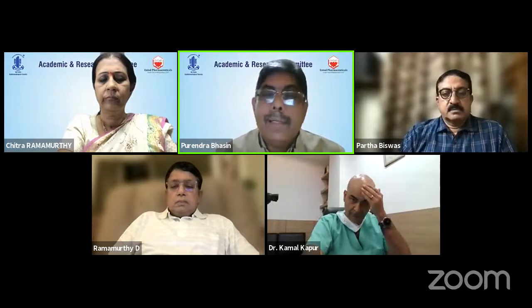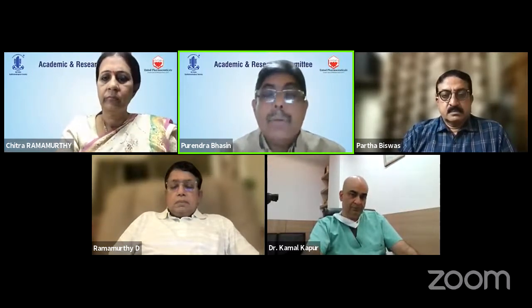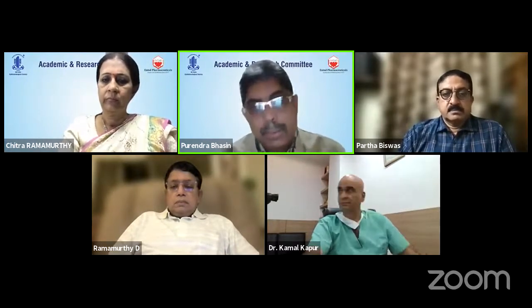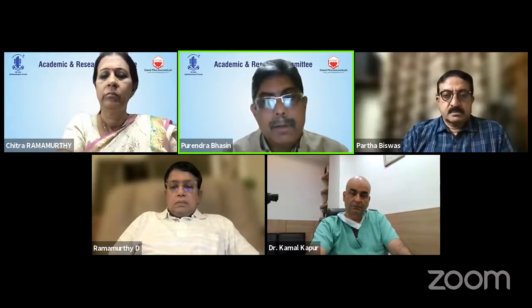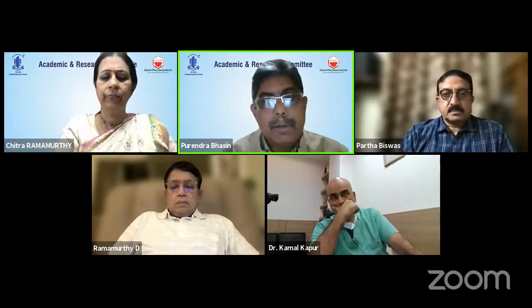And had the refractive error been very high, like 7 diopters, 8 diopters, then I would have gone for a refractive lens exchange with a multifocal or trifocal lens. But in this case, I will prefer going for the phakic lens if the anterior chamber depth is adequate.